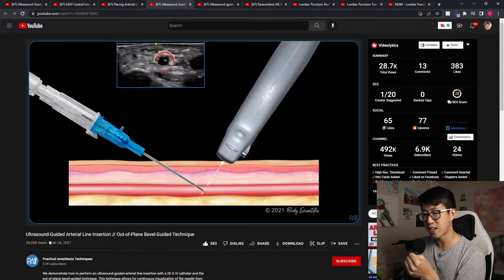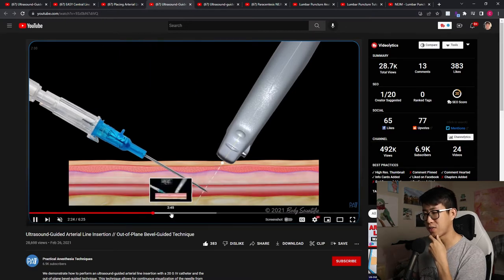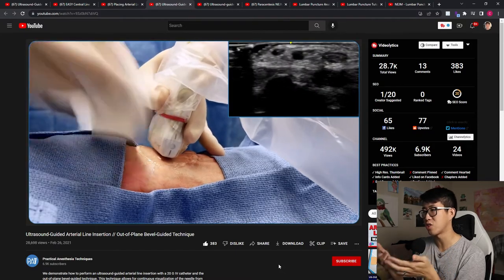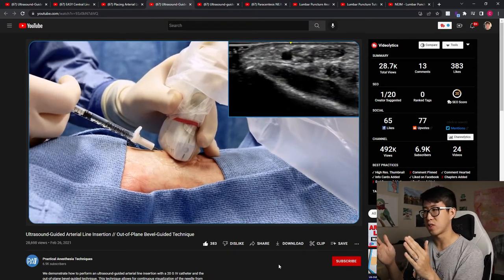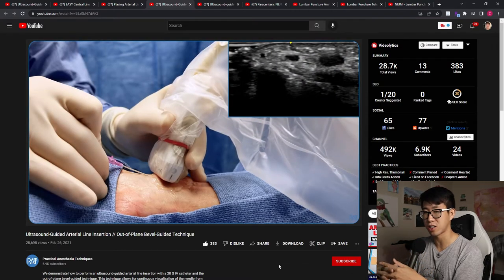This one is ultrasound guided arterial line insertion from Practical Anesthesia Techniques - a very useful video. Here they actually do it on a real patient, which is super helpful because they show you the ultrasound image in real time while explaining the whole process in the lateral view, giving you a really good visualization of what the process should look like.